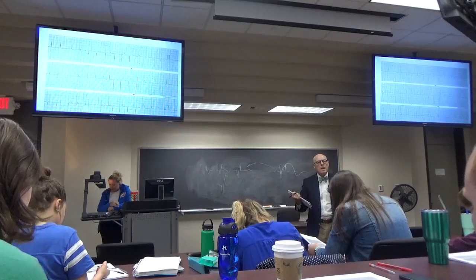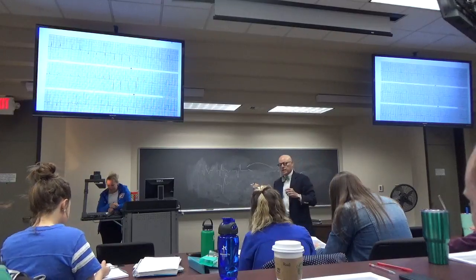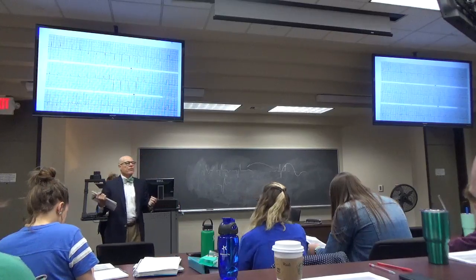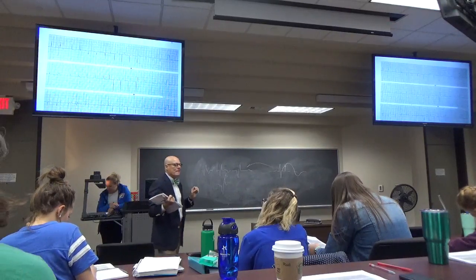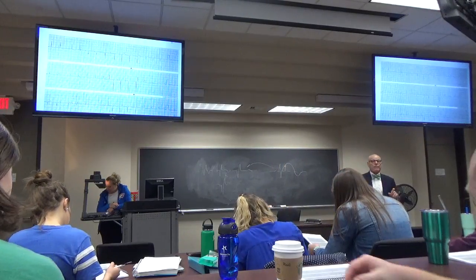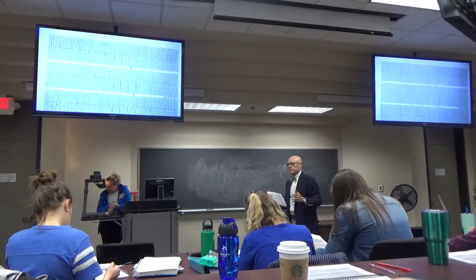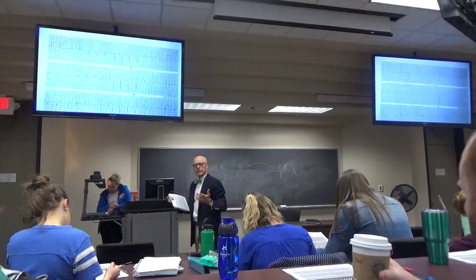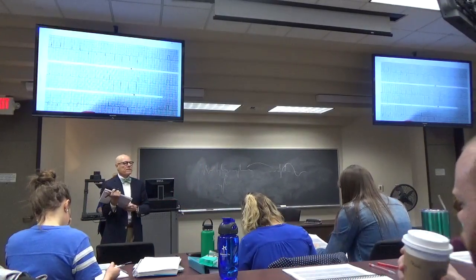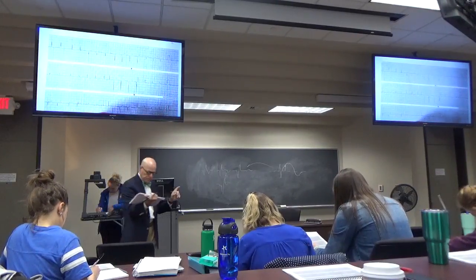I got irregular for the rhythm. I just checked it again. I could be wrong, but. Yeah, no, it's a little bit irregular. Okay. But it's a sinus irregularity. There's a little bit of a sinus irregularity in everybody with respiration, and a little bit of sinus irregularity in everybody, no matter what. So sinus rhythms aren't perfectly the same.